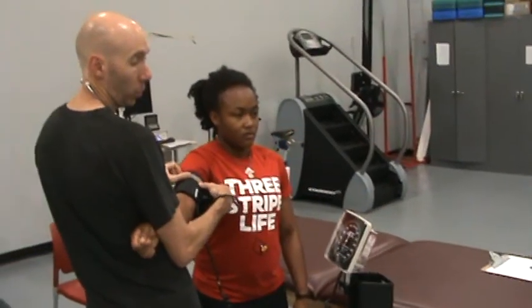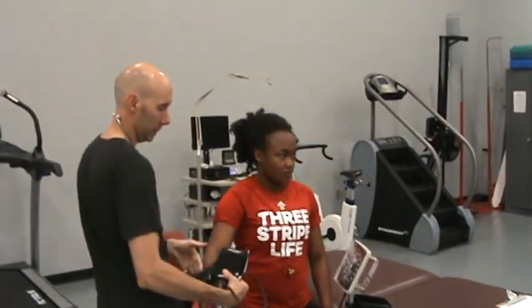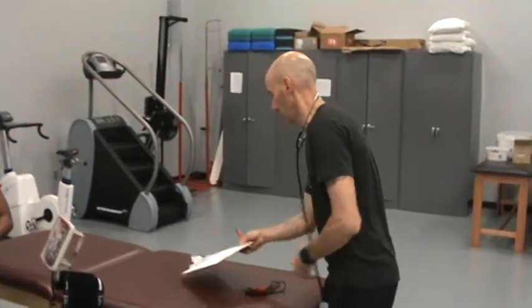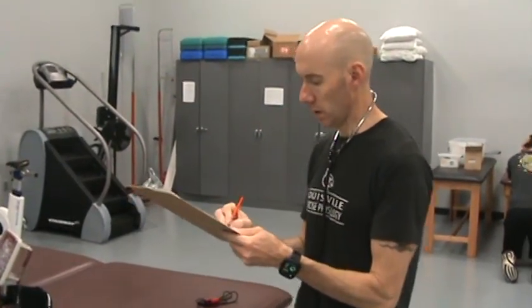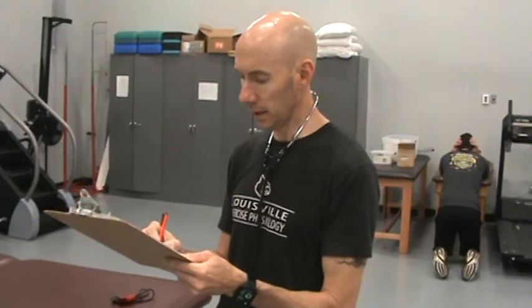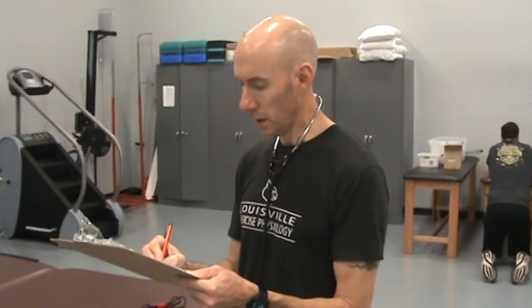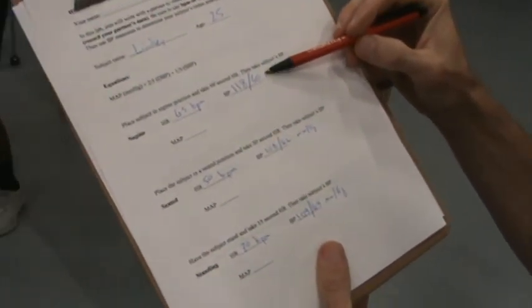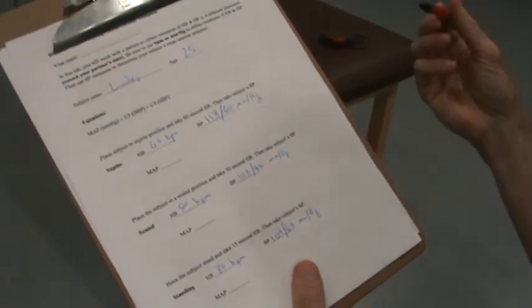Okay, that time I got 104 over 64. So 104 was our systolic, 64 was our diastolic, and again, that's in millimeters of mercury. So just looking at her trends, sort of the opposite of what we might expect. Hers actually went down as we went from supine to seated to standing.